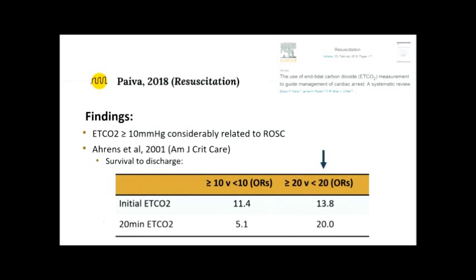Now what I'm presenting on this table are odds ratios here. So what you can see is that regardless if you're looking at your initial or if you're looking at your 20-minute end-tidal CO2, as you move to a higher value, so from 10 to 20, your odds of survival increase as well. So it was a well-structured review.